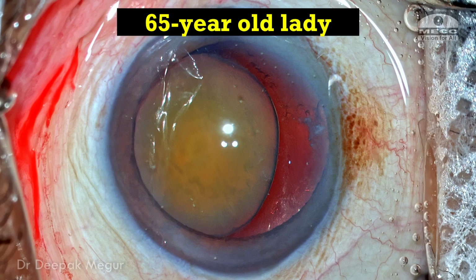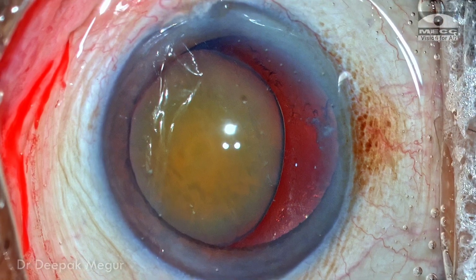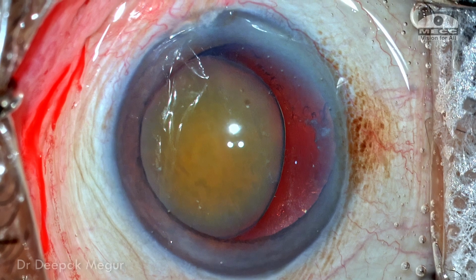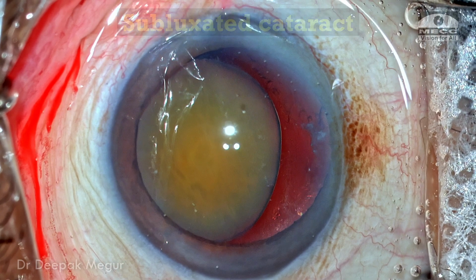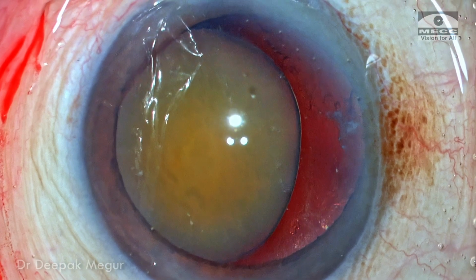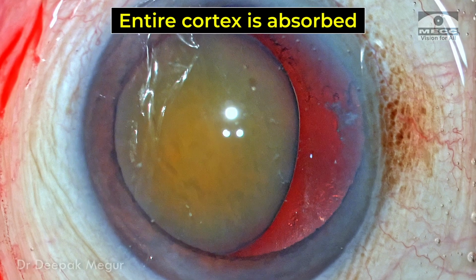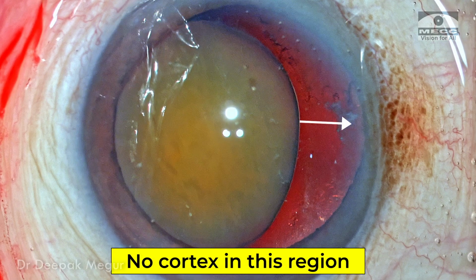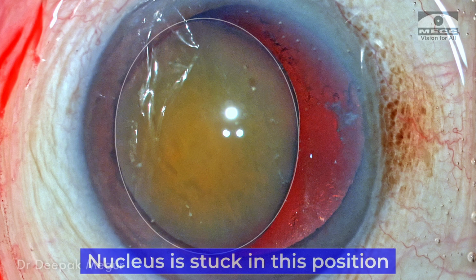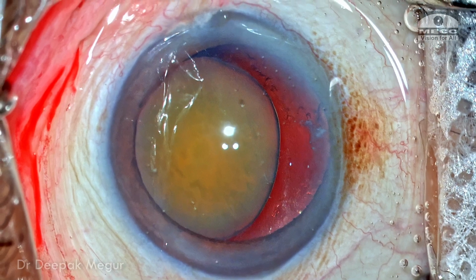Hi. She is a 65-year-old lady who has this very peculiar cataract. On preliminary examination, it looked like a subluxated cataract, but on a detailed examination, it was obvious that it was more of a hypermature Morgagnian cataract where the entire cortex is absorbed and there is an empty bag in this region, and there is this nucleus which is shifted to one position and got stuck there. So this was my interpretation at the slit lamp, and let's see how the surgery turns out.